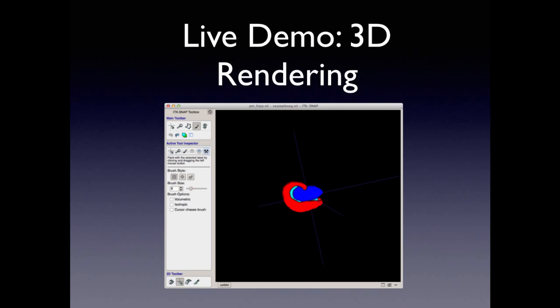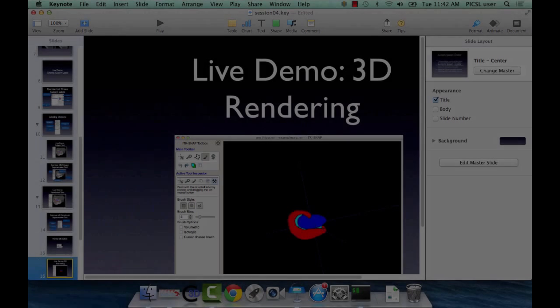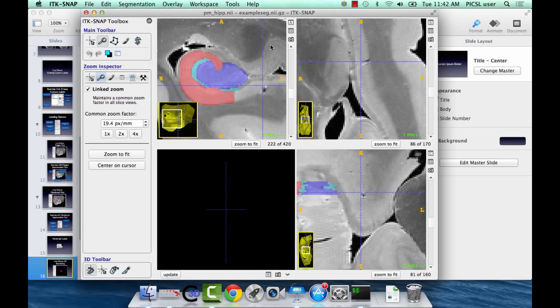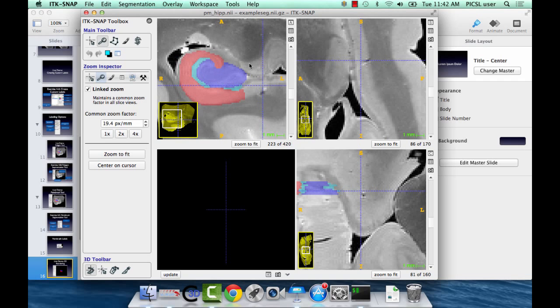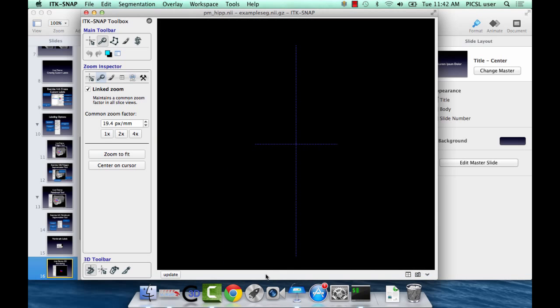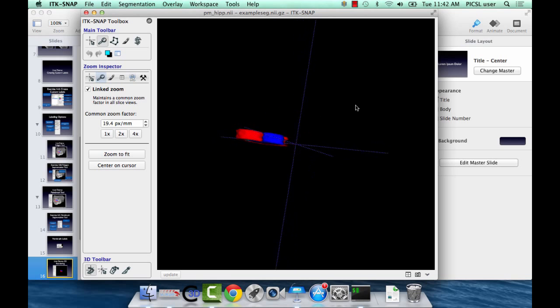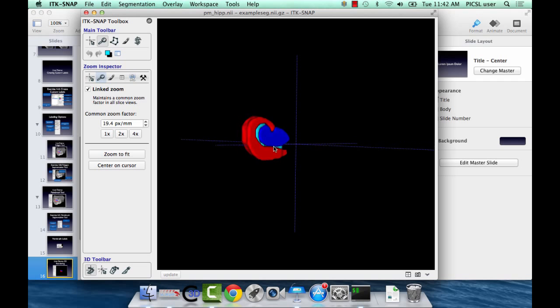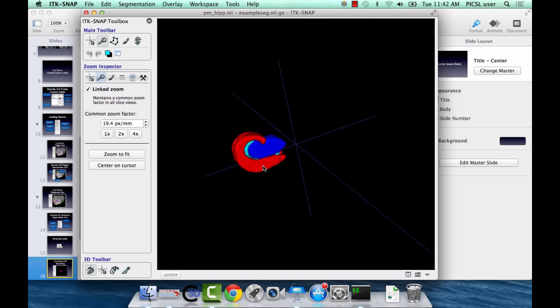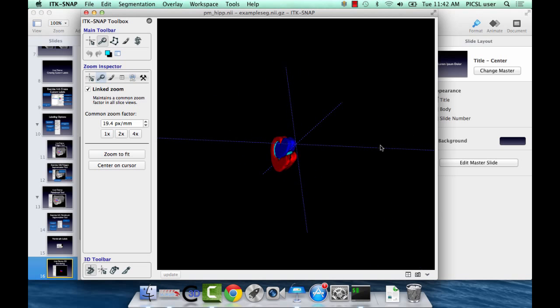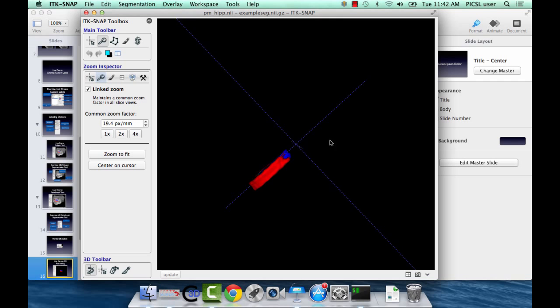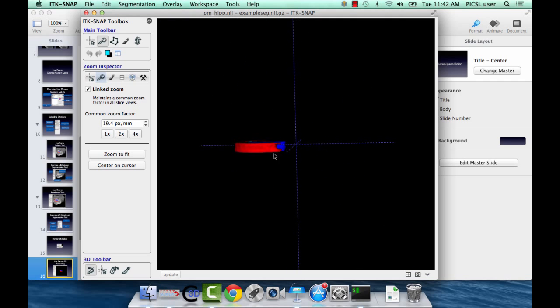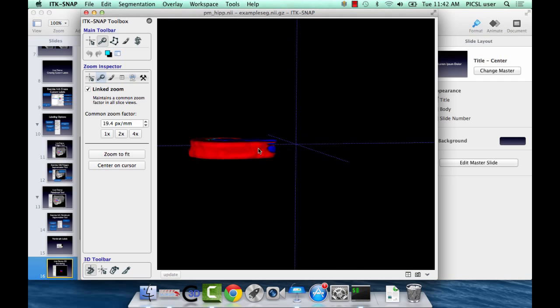The main way to look at your volume as a whole, this is the main thing I do to assess the quality of the segmentation, is doing this in three dimensions. So, here I've done a couple of slices. And if we open up this window and hit update, it'll show you the segmentation in three dimensions. So, here's CA on the outside, SRLM in the middle, and dentate here surrounded by the CA. So, we can rotate this around and see how our segmentation looks. So, the kind of thing I would look for, if you look here, we have this weird kind of thing happening at the CA boundary.